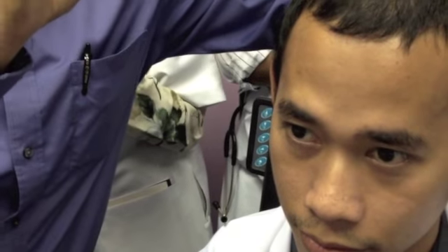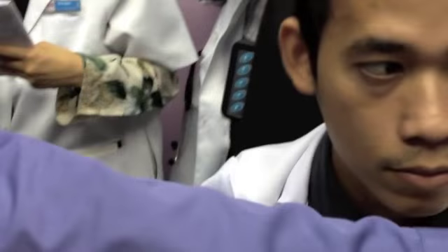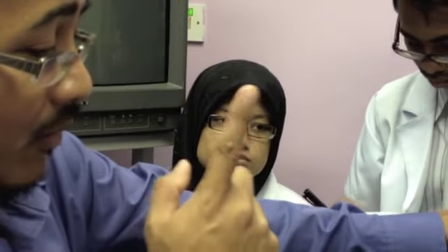Okay. Weber. Done. Next is voice test. Practice this. I will know anyone who tak pegang benda tu. You have to practice this. Now, voice test is just checking the hearing with your voice. Before you talk, you have to know what level your voice is. Berapa decibel. Sometimes your whisper is sama dengan dia punya shout. You don't know, right? So, and then you have to check the patient.